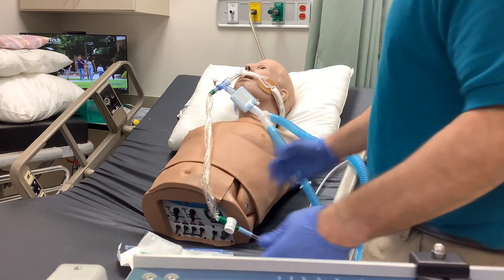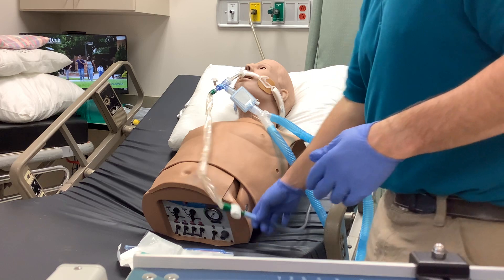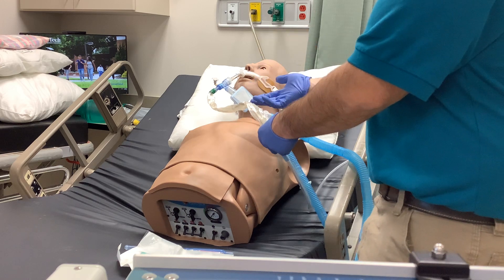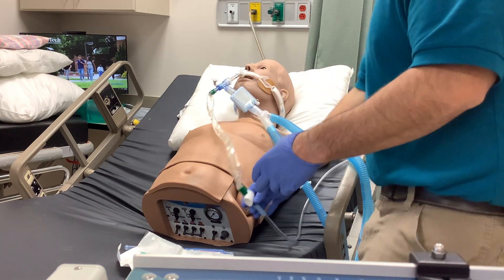I would recommend a brand new Ballard inline suction catheter if you were going to do that. You don't necessarily have to replace the suction tubing, but make sure that you've got a fresh Ballard. We'll pretend this is the first time this has been used on this particular patient — this is a brand new suction catheter.